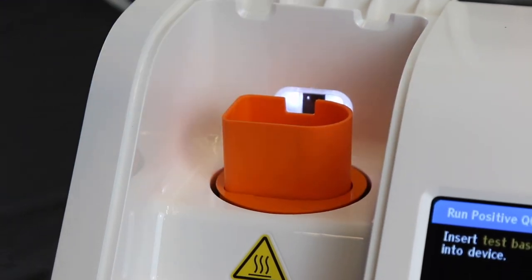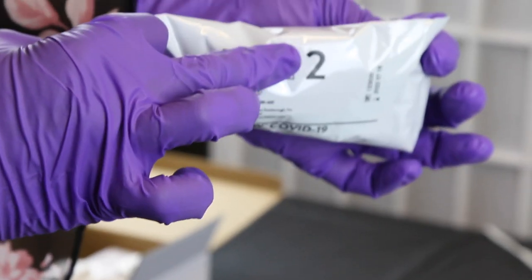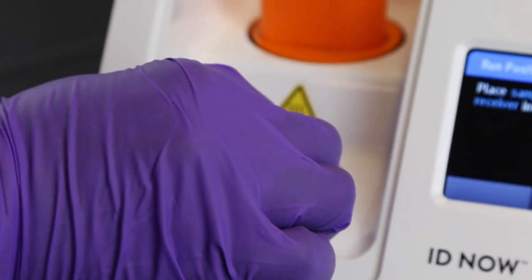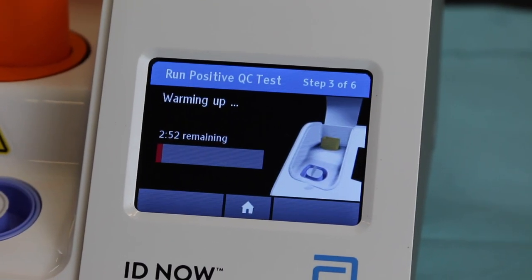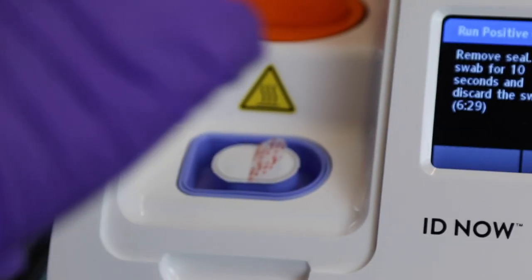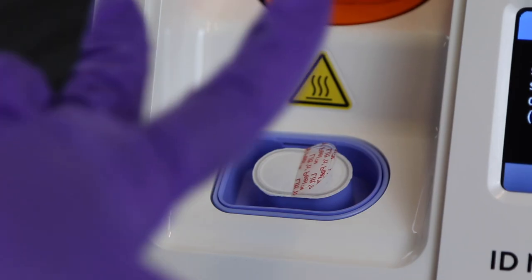Read along with the machine — it will prompt you to insert the base. Then open package number two and take out the blue receiver. Peel and lift the foil tab up slightly; you will not remove it, just lift it. Drop the receiver into the blue well. Do not remove the foil on the receiver. At this time, the machine will do a three-minute warm-up. Once the warm-up is complete, use your index and middle fingers spread apart to hold the receiver down while carefully pulling off the foil to expose the fluid inside. Be sure not to lift the receiver out of the well, as the machine may reject it.